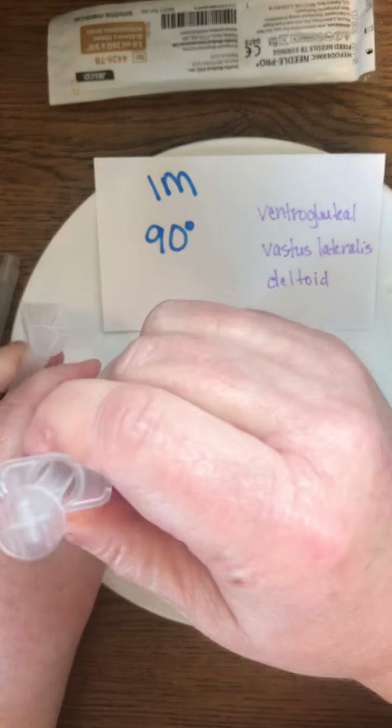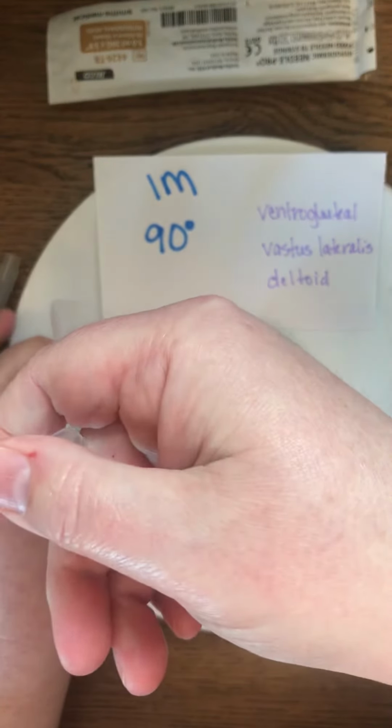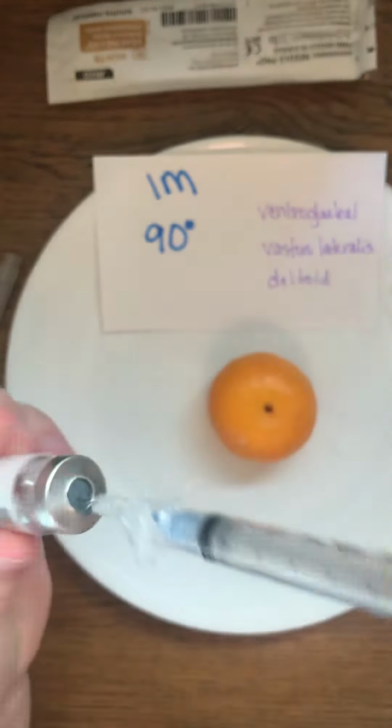And then, like before, we're going to inject our air into our vial. We're going to flip it over and get all the air out.